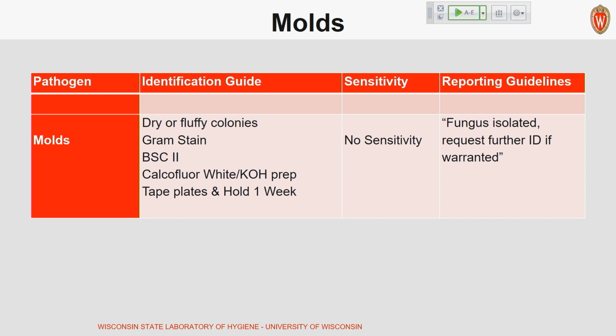Doing that calcifluor white, or possibly a lactophenol cotton blue if you have that. And then, making sure to tape those plates, because it's most likely going to land back in that incubator and be part of potentially your routine cultures, because this is from bacterial media. So if you're encountering this on bacterial media, you do want to call that out. But it's going to be up to your institution's practice whether or not you actually want to work that up, because you could have that range of environmental contaminant all the way to potentially lethal.